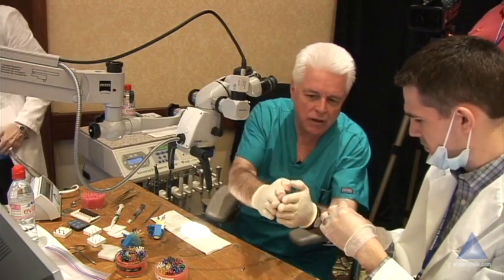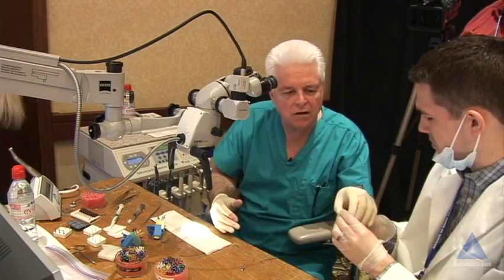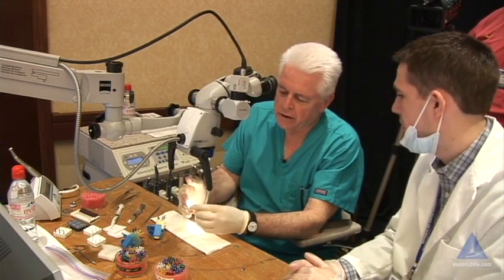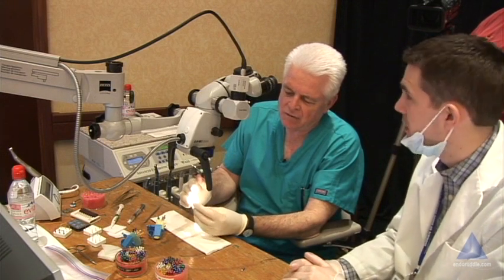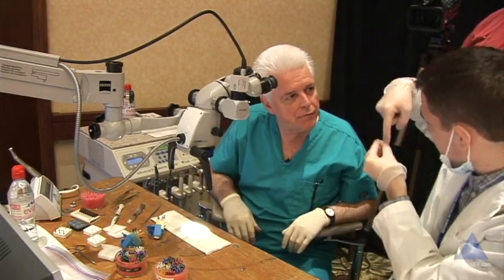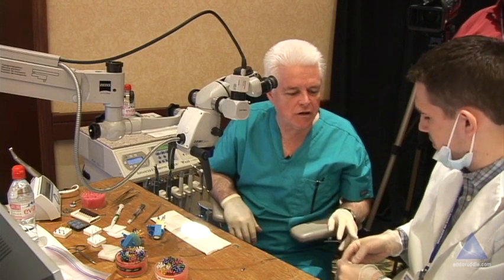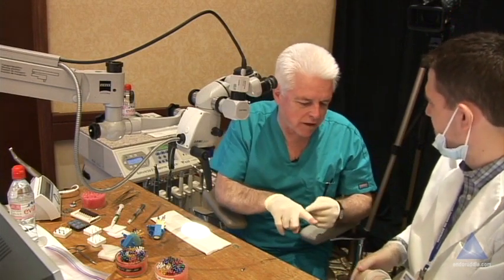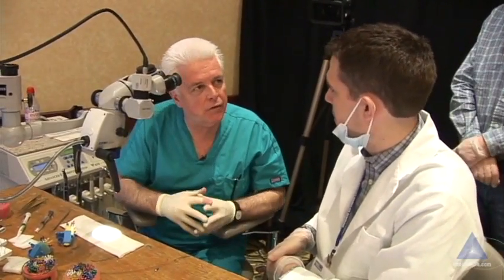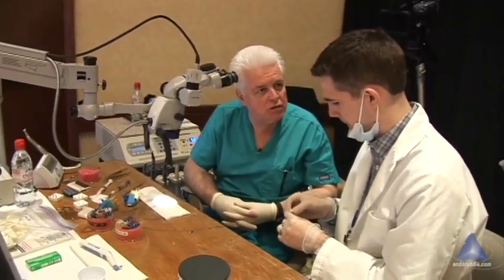Your mid-mesial might join the MB or it might join the ML. If you cheat and flip your tooth over, which I encourage you to do frequently — because that's what you can't do clinically — there's a lot to learn by just studying teeth. I'm looking at furcal side concavities, being reminded that even straight roots hold complicated canals. The lesson on my access is just kick it out a little bit more. Use your Gates or X-Gates. It would have been a little tricky to do that with the SX to cut where we wanted without running it down where it wasn't safe. We got a little indication of that because we could start to see debris on the apical flutes — which meant we're cutting towards the tip, and that's more dangerous.